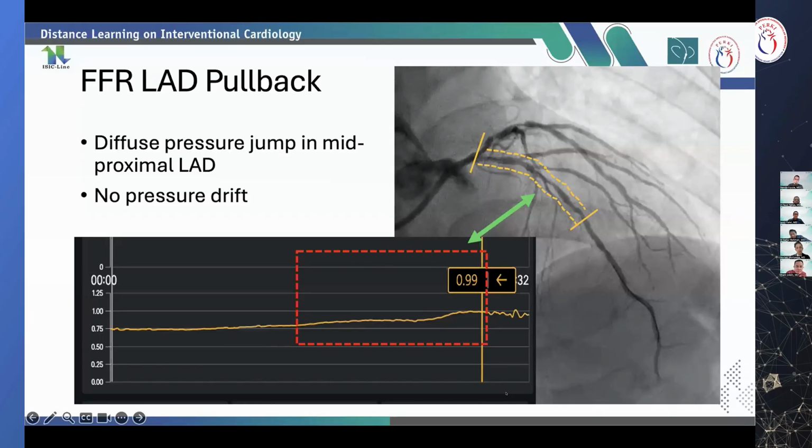So, a brief question. Whether you put the stent all the way from the distal part to the left main, or two stents, or one stent, what is your strategy, Dr. Ilham? No, I was just thinking, because the left main is a very large territory, about 70%.